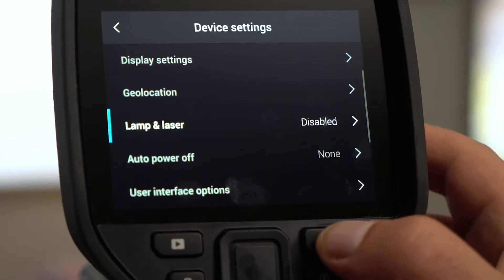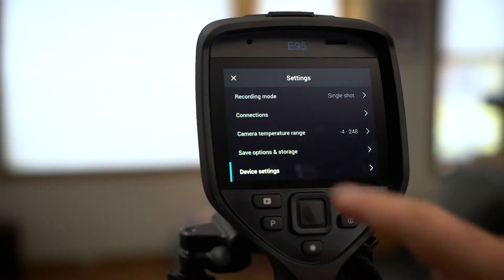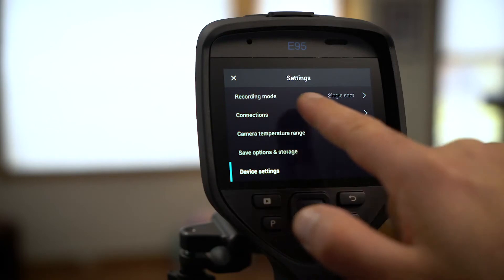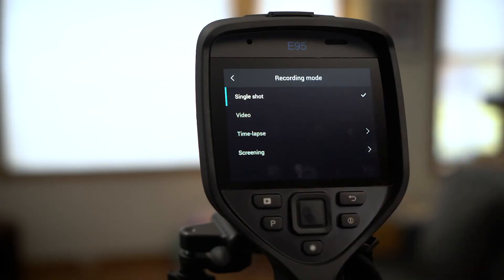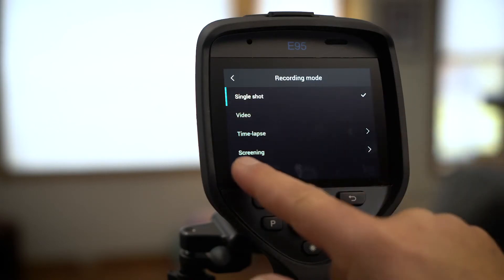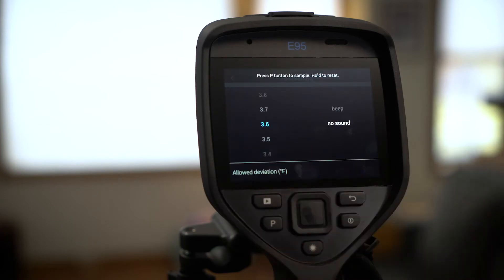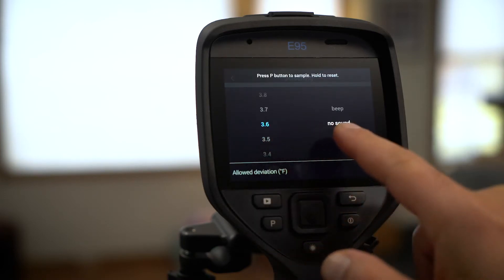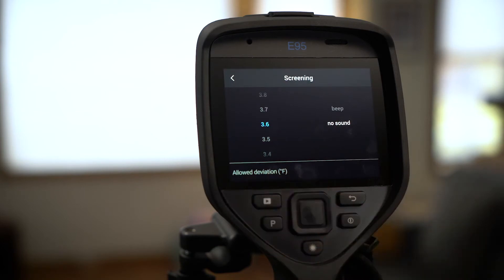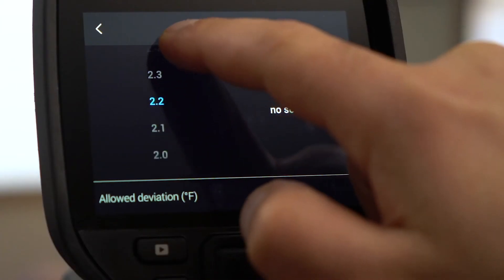Next, click the back button. Now we need to set the imaging mode to screening. Select screening. Here's where you can set your alarm threshold. We're in degrees Fahrenheit, so we'll set the threshold to two degrees.